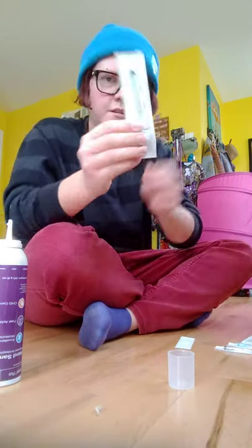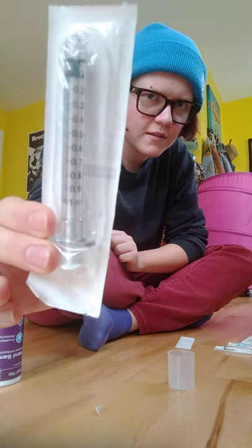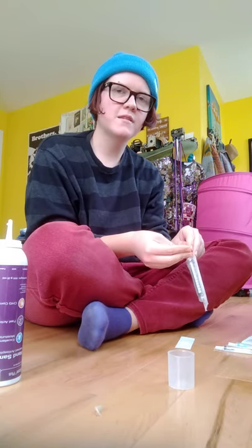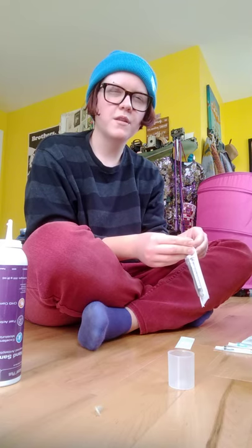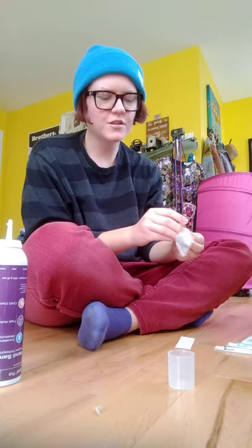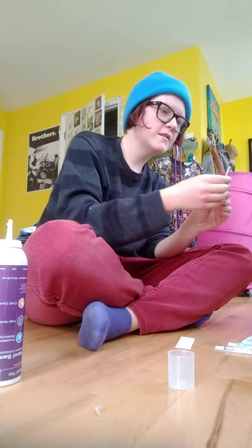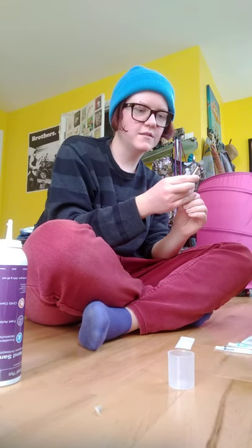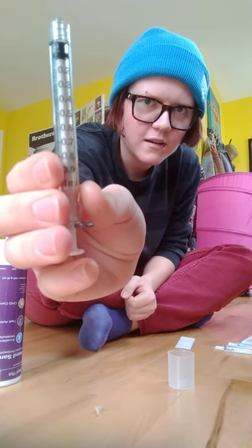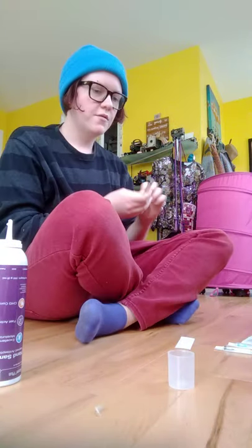You're going to need a syringe — this one's one milliliter. The average amount of T that most trans masculine people take is about 0.25 to 0.3 milliliters a week. A syringe smaller than a milliliter is easier to read, but this one is nice because it goes up by tenths of a milliliter: 0.1, 0.2, 0.3.